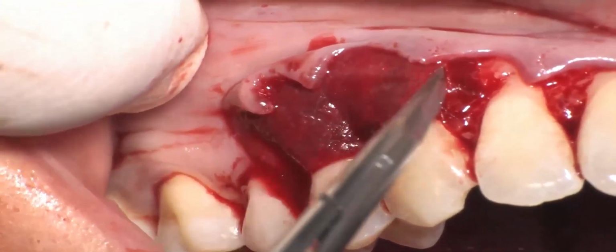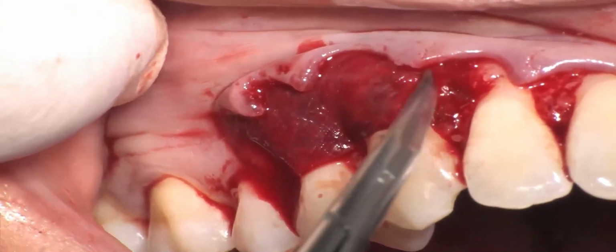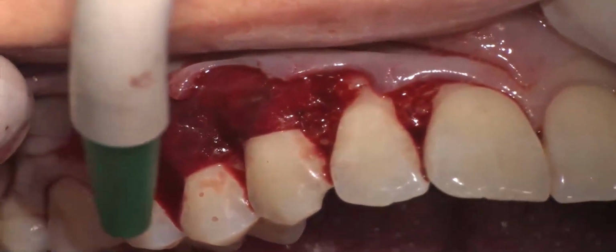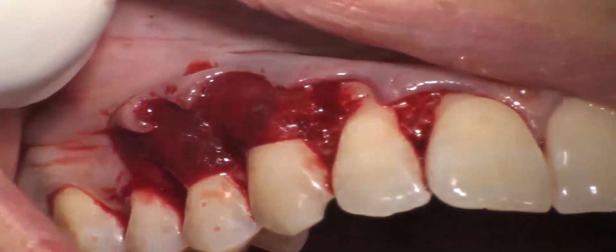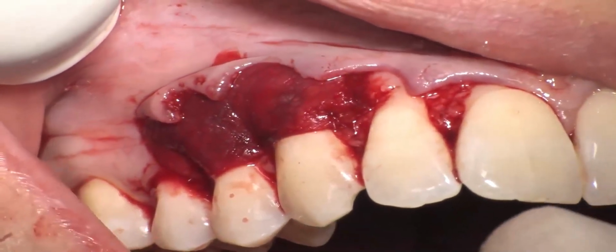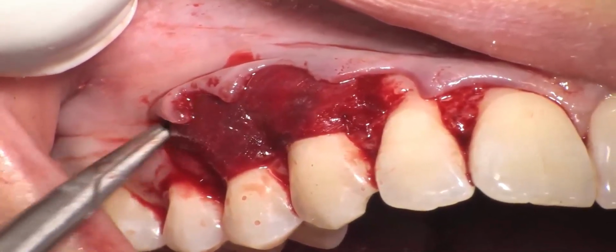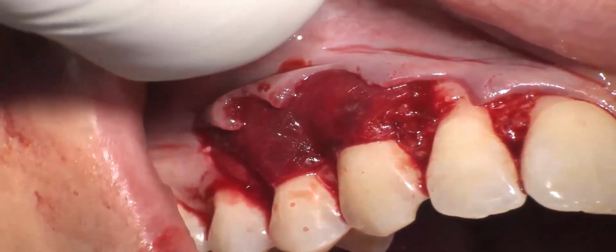Okay, the problem with this material is its main advantage, that we cannot suction too much on it, because I want you to see how in the profile, how much this material is able to incorporate blood.